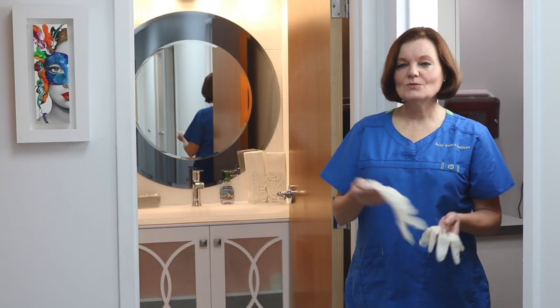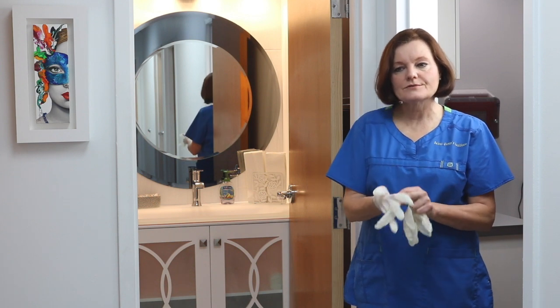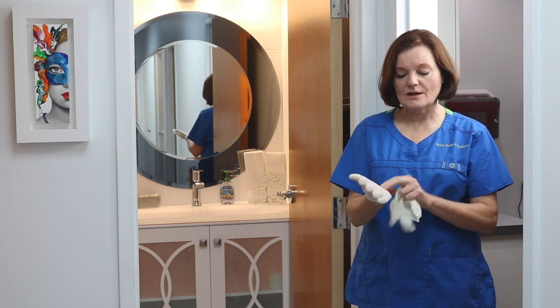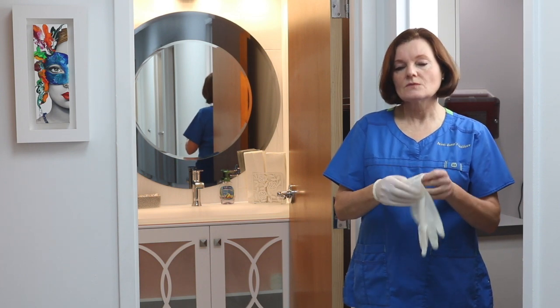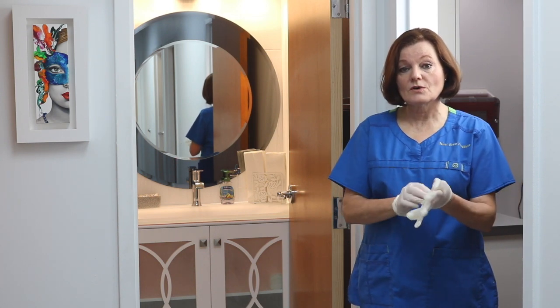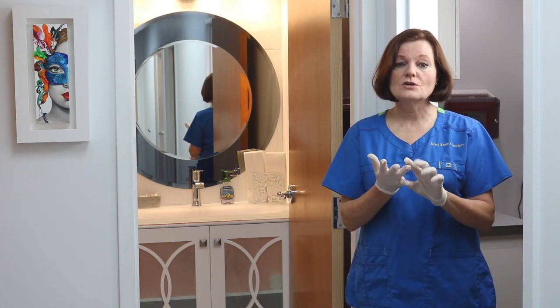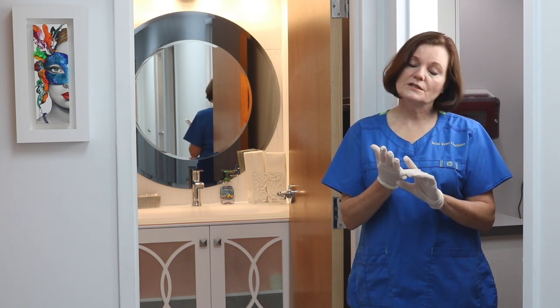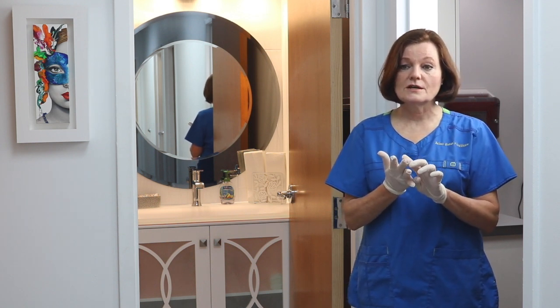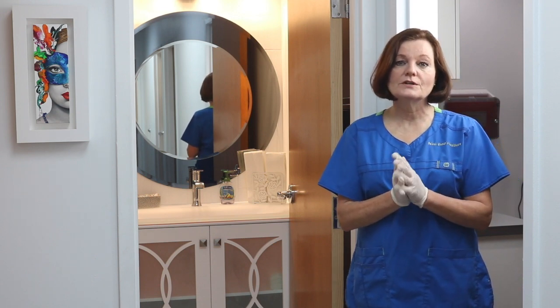We're going to be discussing what constitutes a good urine specimen. We're going to look at what the provider's looking at when they're looking at your sample, which would be the amount and clarity, and we'll go through those components of what actually is in the urinalysis, like the glucose, the ketones, your specific gravity, blood, pH, protein, nitrites, and leukocytes. All 8 of those components are what are important when viewing a urinalysis.